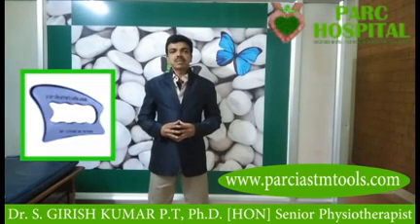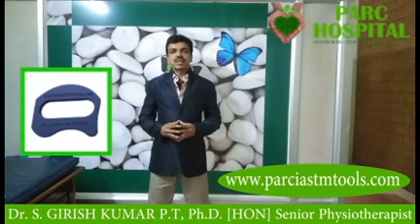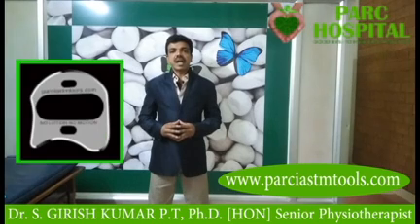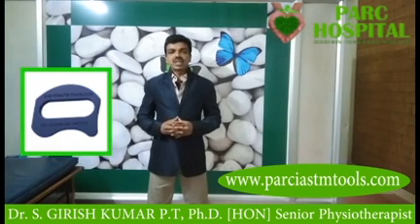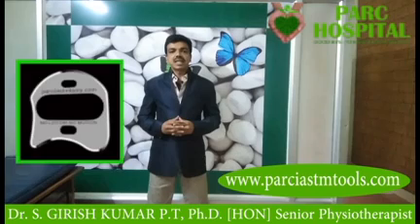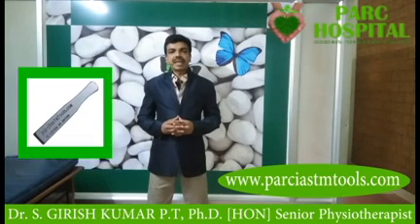The IASTM treatment is thought to stimulate connective tissue remodeling through reabsorption of excessive fibrosis, along with inducing repair and regeneration of collagen. The instrument is thought to provide a mechanical advantage for the clinicians by allowing deeper penetration.